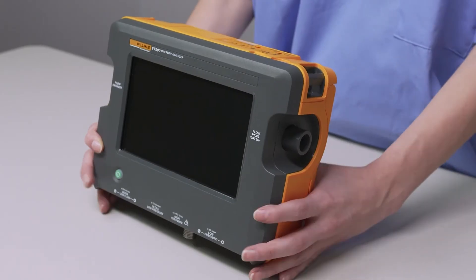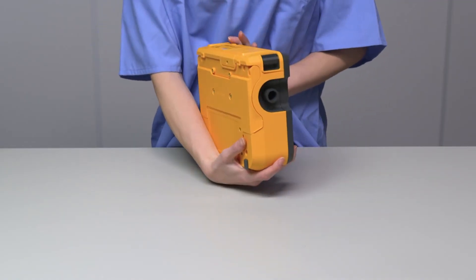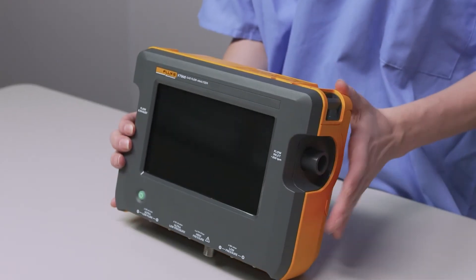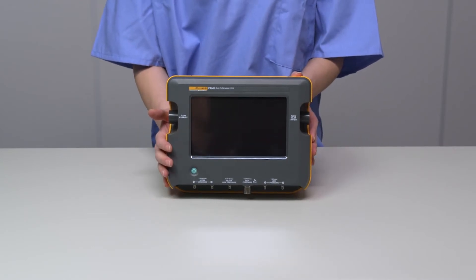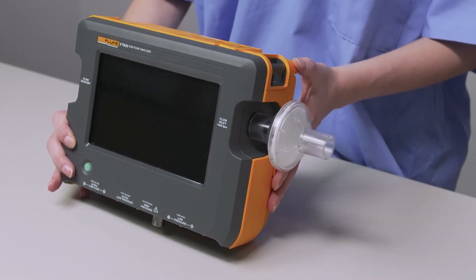On the right-hand side of the device we have the flow inlet, and on the left-hand side, the flow exhaust. For bi-directional flow testing, we hook our respiratory tubes on the right and our test lung on the left. When using the airway channel, it's best to use the external filter. Snap the filter on the inlet to help keep measurements steady and protect the unit from contaminant matter.